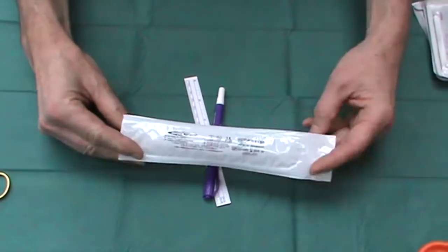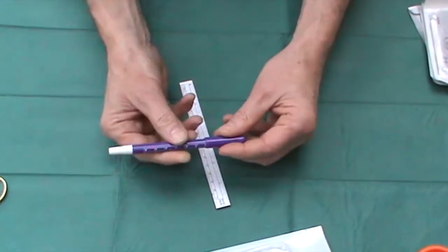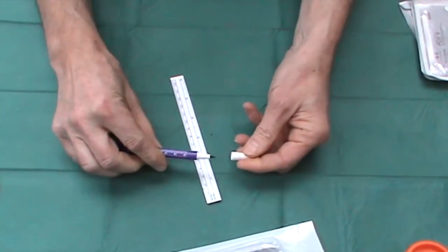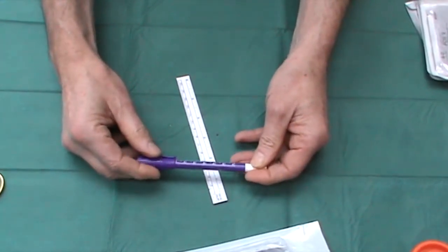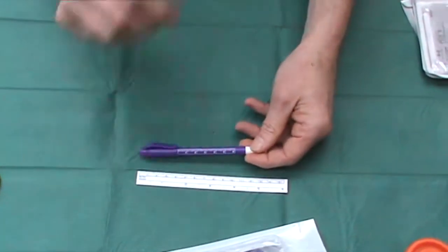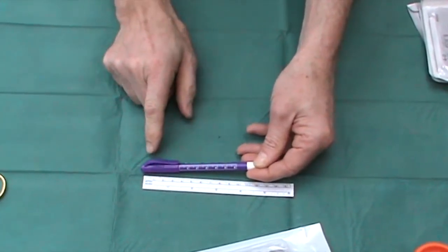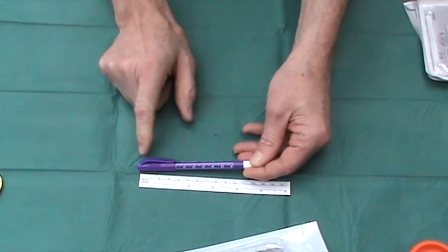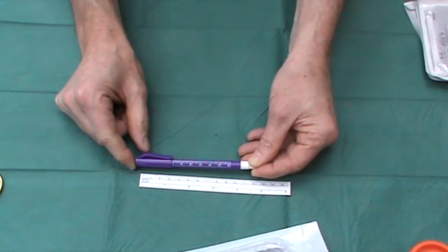As far as marking the skin is concerned, I tend to favour these types of twin-ended skin markers. They have a coarse end and a fine end, and these are perfect for marking before surgery. They have their own built-in measure, but they also come with a small ruler, which is very useful for working out not only the margins around a lesion, but also for that perfect three-to-one ellipse excision to get the actual dimensions correct.